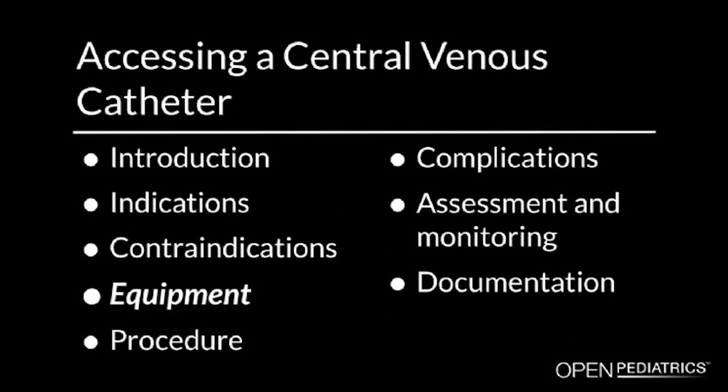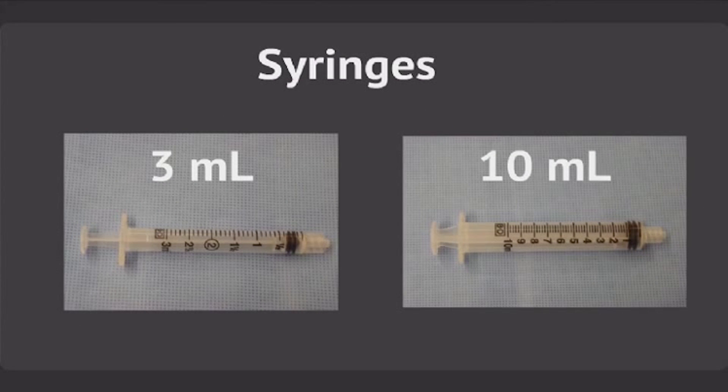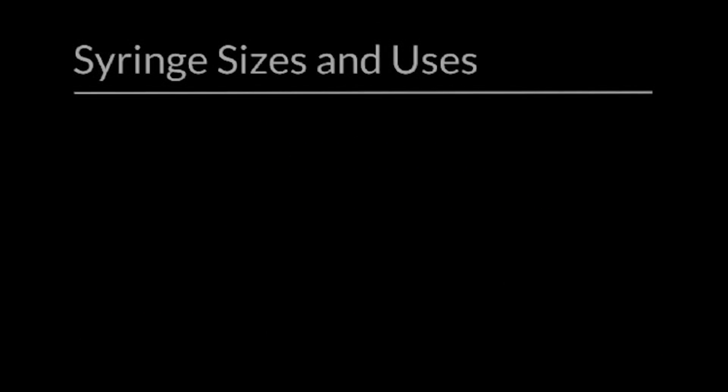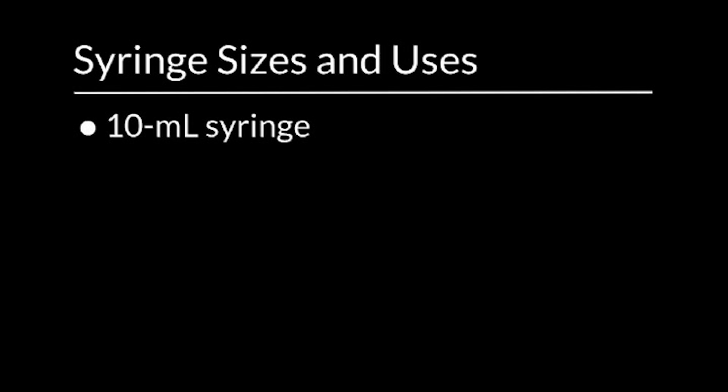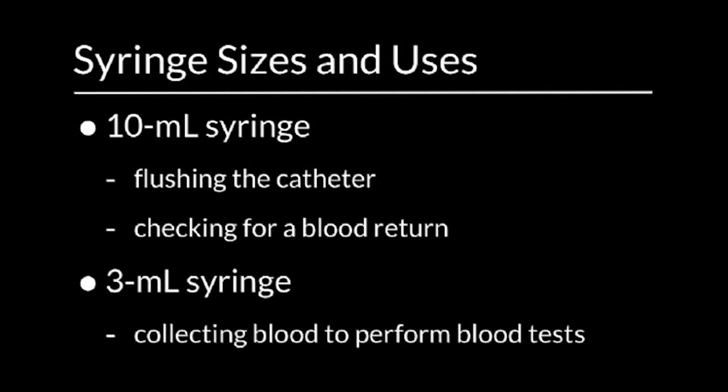Equipment. You will need the following equipment to perform the procedure: a 3ml syringe, shown here on the left, and a 10ml syringe, shown on the right. Note that two different sizes of syringes are generally used for this procedure. A larger 10ml syringe is used for flushing the catheter and checking for a blood return. A smaller 3ml syringe is used when collecting blood to perform blood tests.